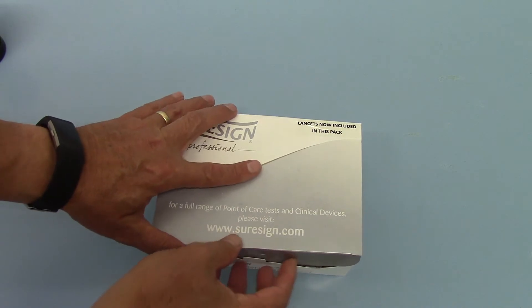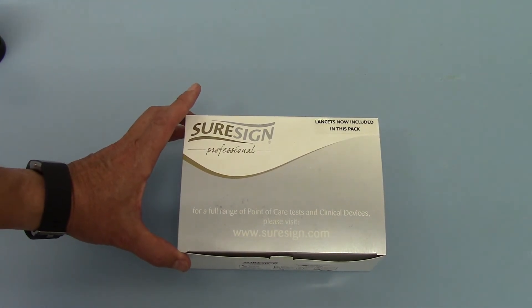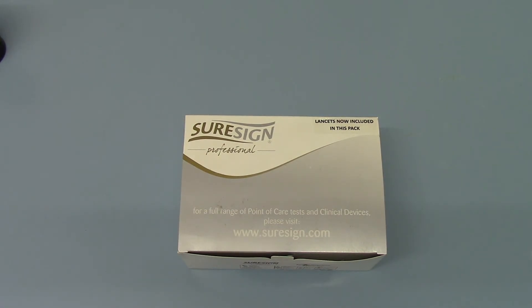These are packs of 10. No additional equipment is required to undertake the full test, and they are available from the Valumed website online.